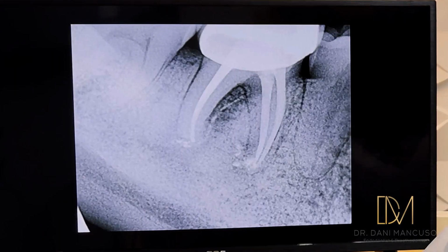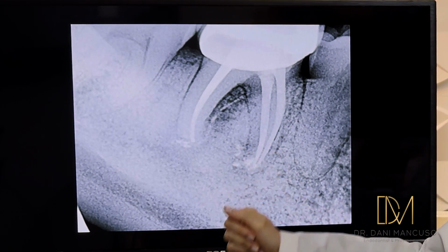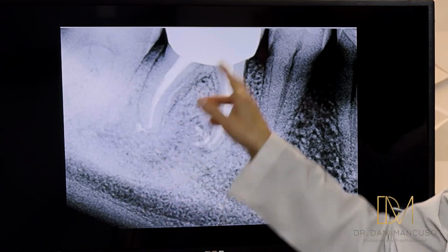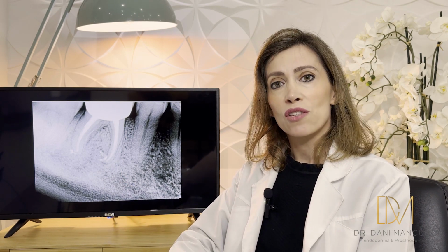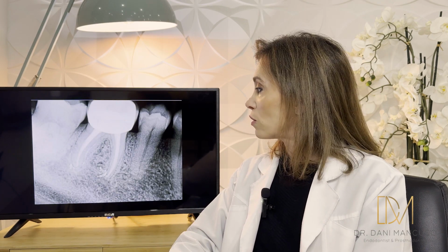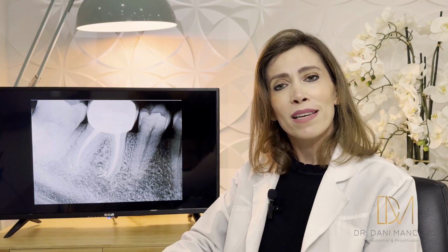So we finished the tooth. We obturated with a single cone obturation with a bioceramic sealer. And the patient came back for a review in 1 year. In 1 year, the crown was absolutely fine. Why 1 year? Because the crown was fine. The patient didn't have to have any crown changed. This crown was quite new. At 1 year, he came back and we took an X-ray and we were very happy with the healing. And in 2 years, we took another X-ray, very happy with the healing. Some patients we don't tend to review that long, but in this case I wanted to see how it was going to behave.